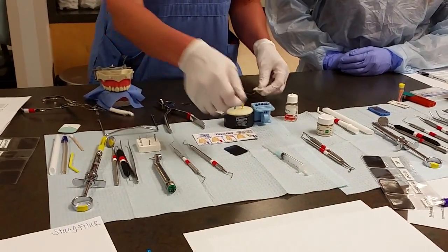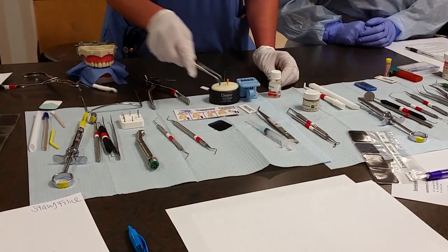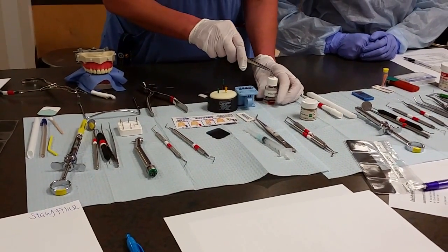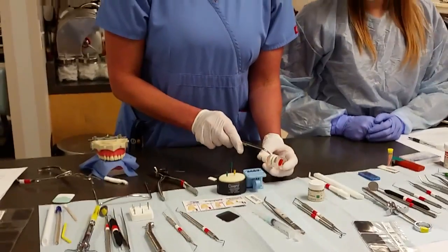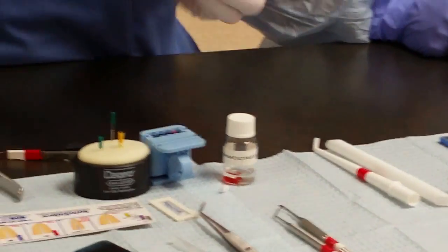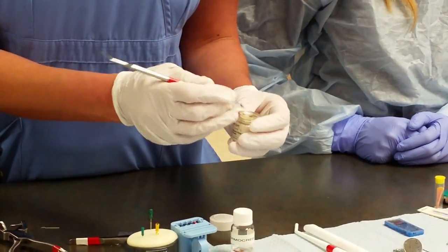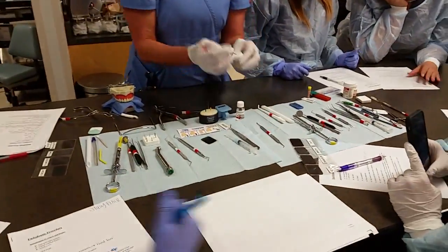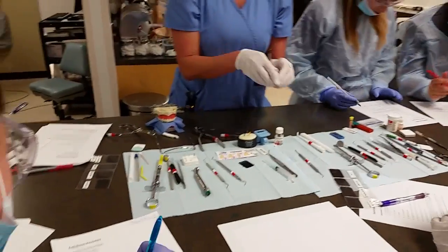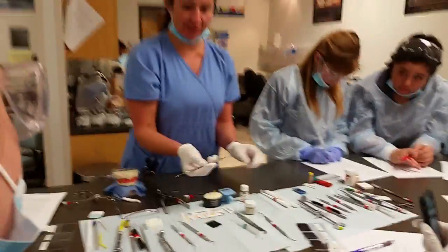We keep handing paper points to the dentist until the canal is dry. Once dry, this first procedure is called the open and drain. We then place formocresol — a medication that kills any infection inside the tooth — into the canal. We then use the Glick instrument and place Cavit, a temporary material, on top of the tooth using either the Glick instrument or the beaver tail and a condenser.